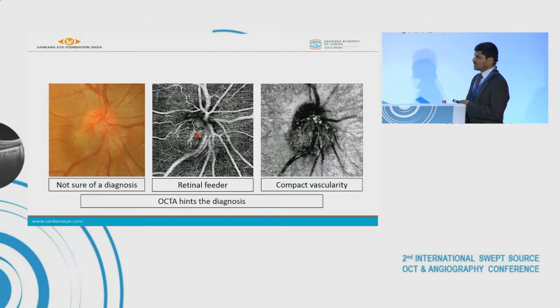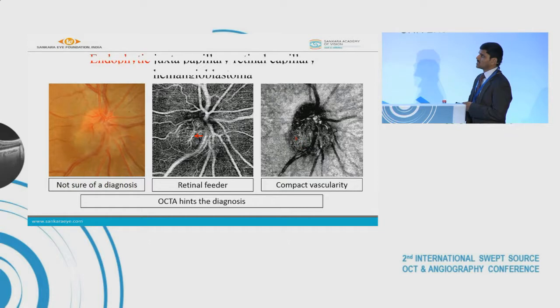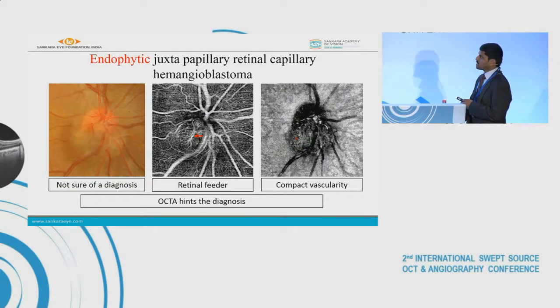OCTA gives a hint to the diagnosis that it is a vascular tumor with a retinal feeder. So it is most likely an endophytic form of juxtapapillary retinal capillary hemangioblastoma.